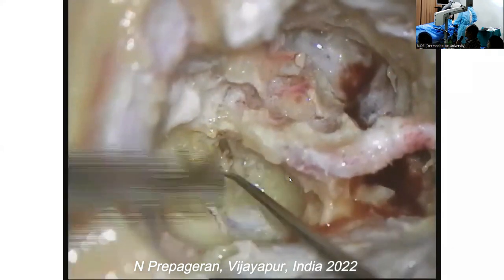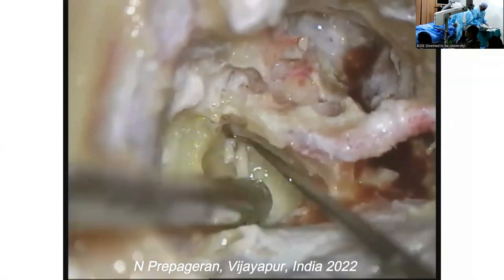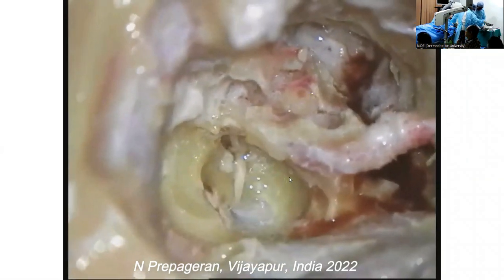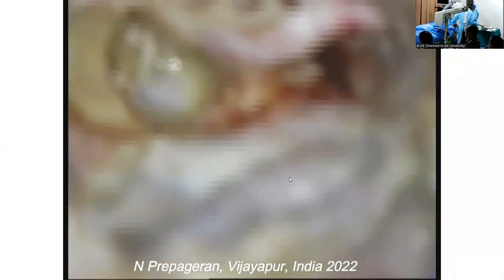Oh, we're still using the same big fat sucker. We haven't changed yet. Never mind, it's okay. I'm almost done anyway. Can you see? One, superior vestibular, inferior vestibular, cochlear, and facial. Okay. Transcochlear. And then you guys can party, okay? The cochlear aqueduct, can you show?